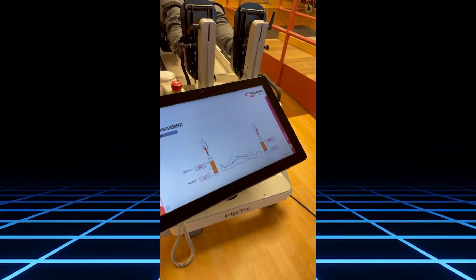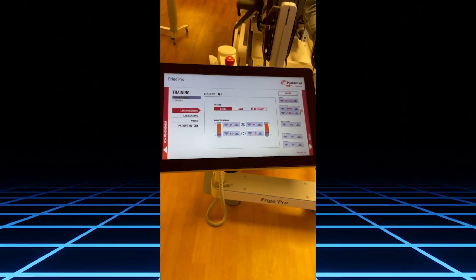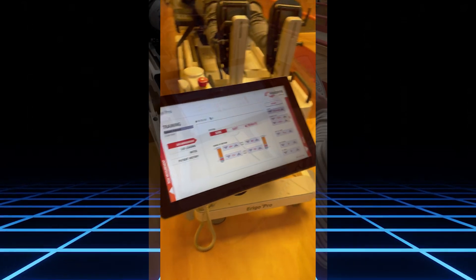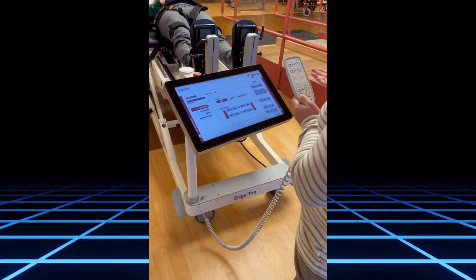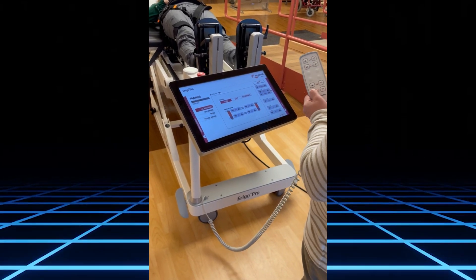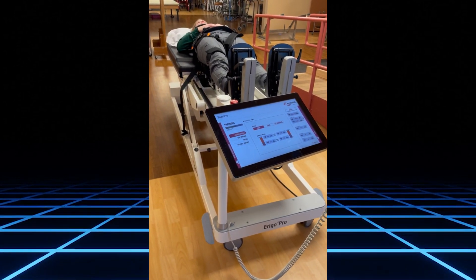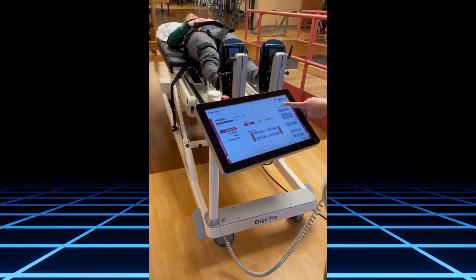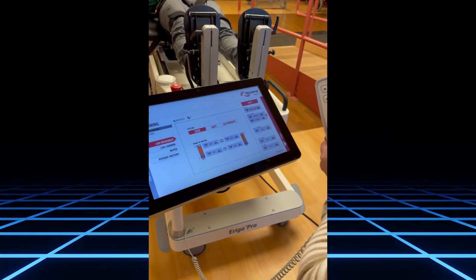Once you've done that, hit Training and you are ready to start the program. Before bringing the patient to the full upright position, make sure the table is all the way elevated. The default cadence will be 16 steps per minute.